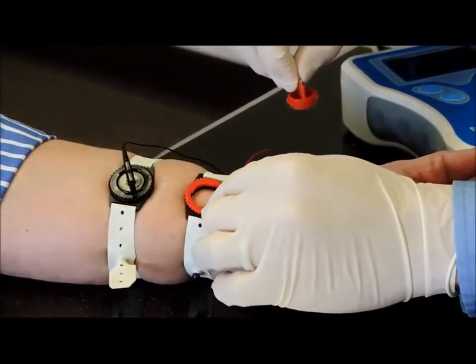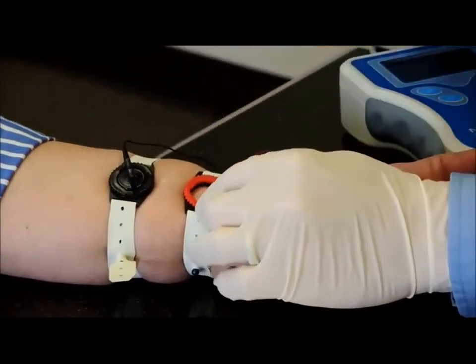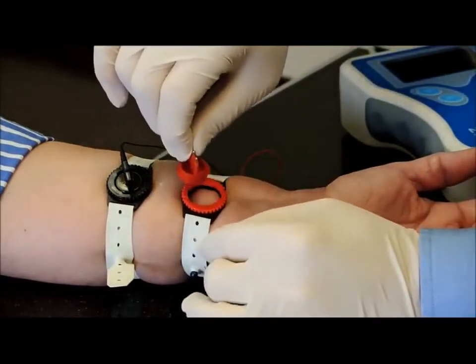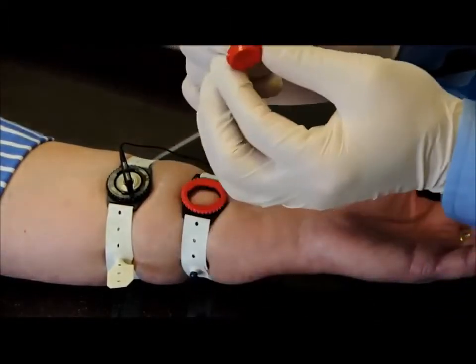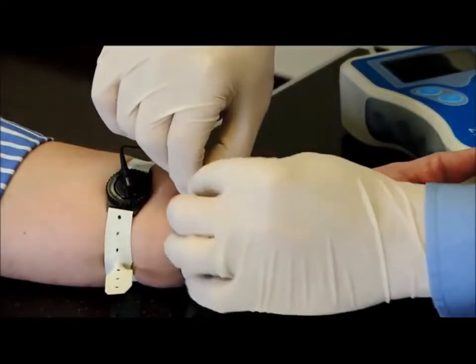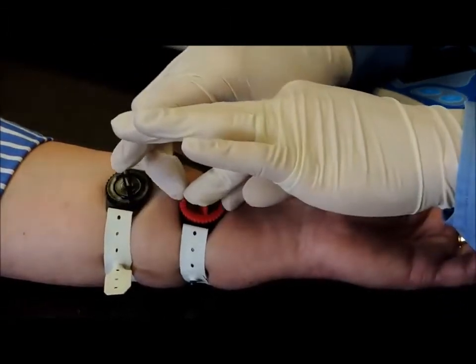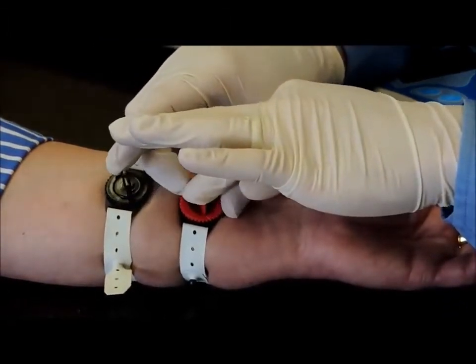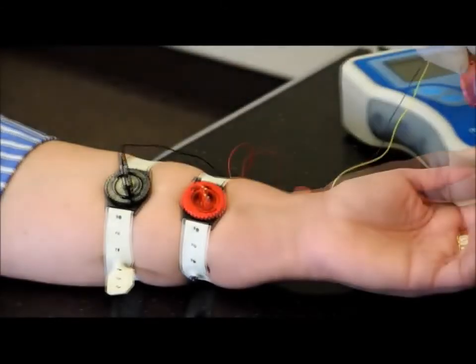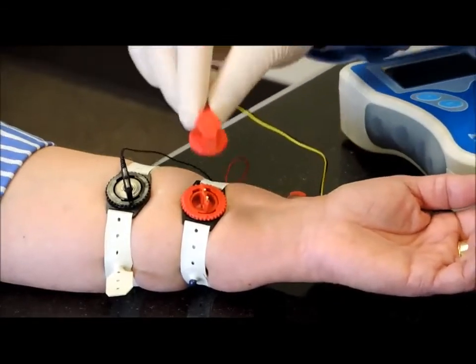So again, I move the ring. I notice a small little piece of dust from the swab. I'll take that out. I move the ring so that these flanges on the sensor cell can go down all the way to the skin properly. I push down, and then I move the ring again 45 degrees, and so it locks it in place. So now with the sensor cell in place, I'll connect the cable to the sensor cell.